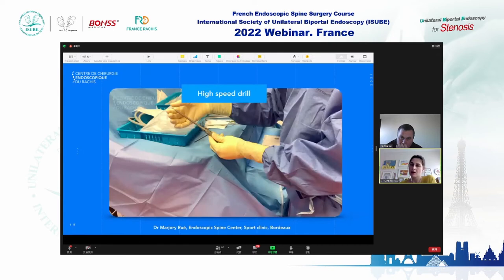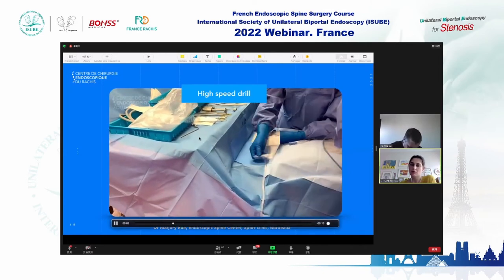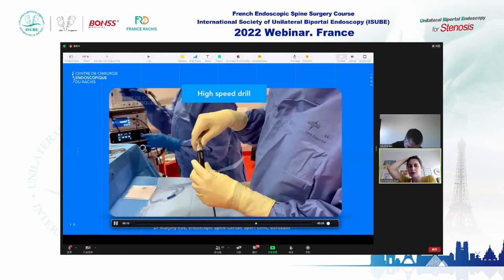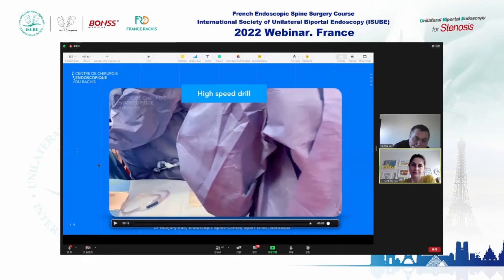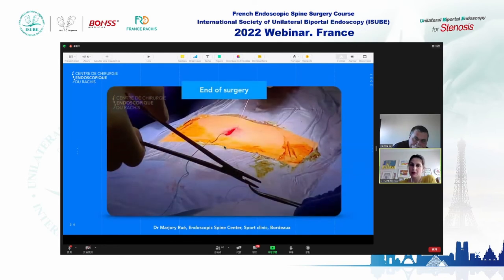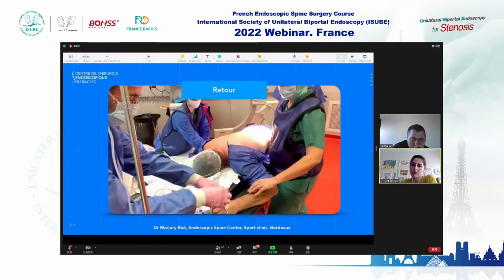I use a high-speed drill, which is quicker and comfortable to remove bone — especially for bilateral lumbar stenosis when you are drilling the spinous process. That is the end of this type of surgery: two-to-three centimeter technique, then suture.